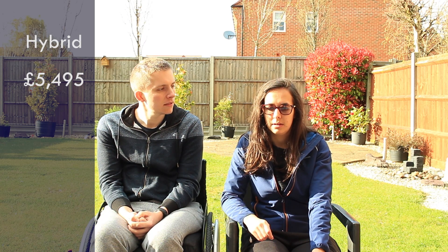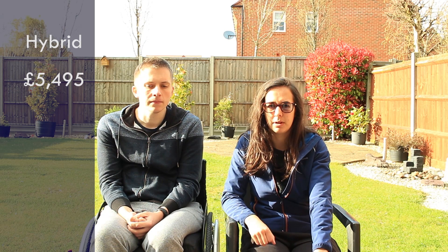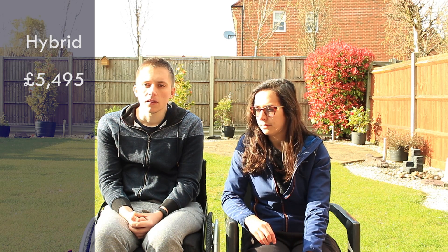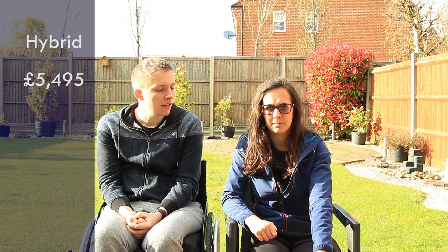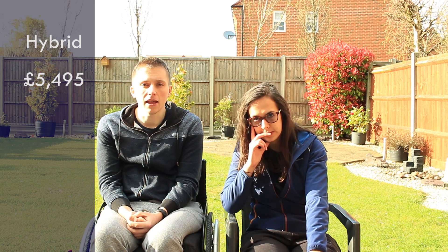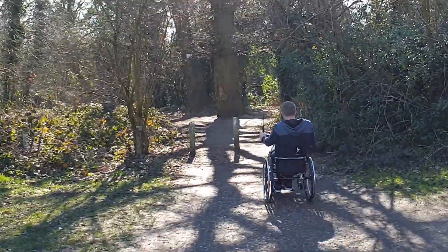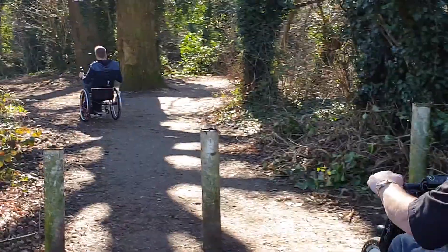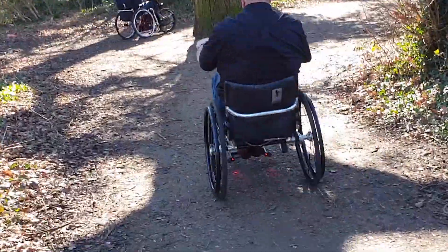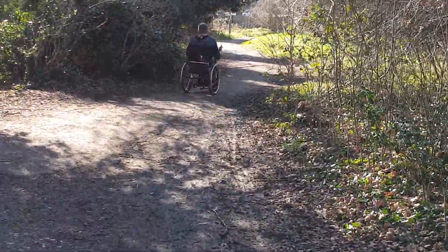In general it was quite good — best one I've tried yet. It definitely looked robust, and from people we've heard from who've had them for a while, they seem quite robust. If you want quality, you go for Batek generally. We've heard if anyone has other experiences, please let us know. We went for a test ride — he let us take a ride around. At the hospital it was just a very small outdoor patio area, not a great representation of how it works outside. Whereas with the Cyclone rep we went about a mile or so loop around the local streets and it handled it very well.